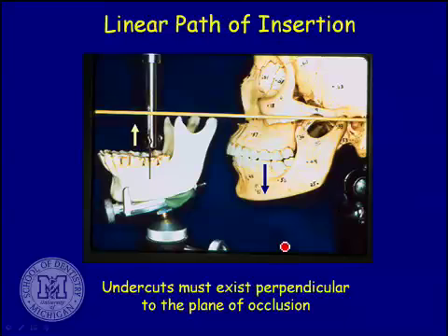So sometimes in the pre-clinic even, and in the books that they were talking about at the time I was in school, I was always sort of left with the impression when I took partial denture in undergrad that if you took a model out of a patient's mouth, took an alginate, poured up, mounted up, if I fiddled with this thing enough on a surveyor, if I dinked and fiddled around, I could find some orientation of this cast that would satisfy all the requirements that were necessary to make a nice partial denture framework. I was just always too dumb to find it.